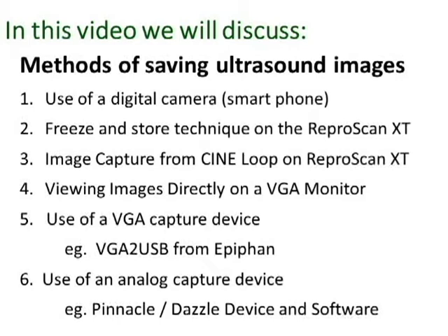Additional methods include viewing the image directly on a VGA monitor, use of a VGA capture device such as the VGA to USB from Epiphan, and use of an analog capture device such as the Pinnacle Dazzle device and software.